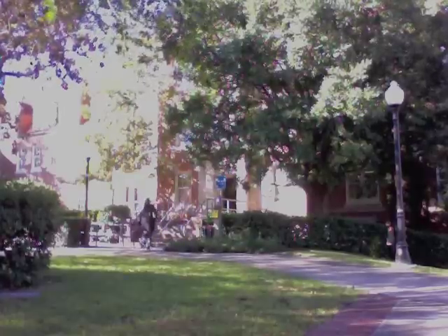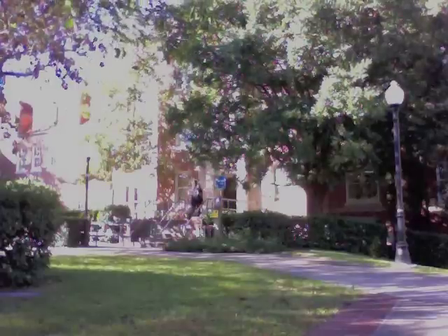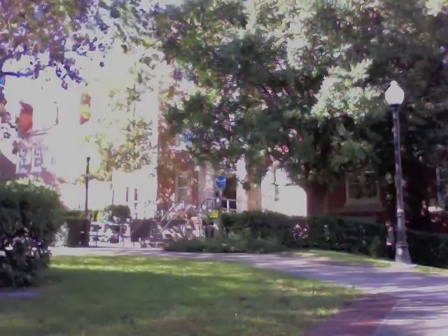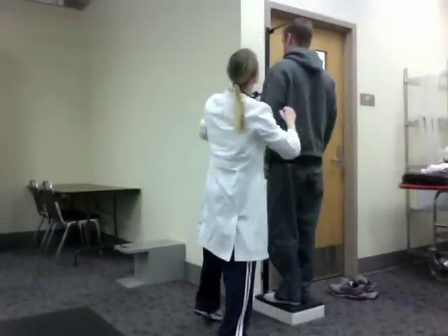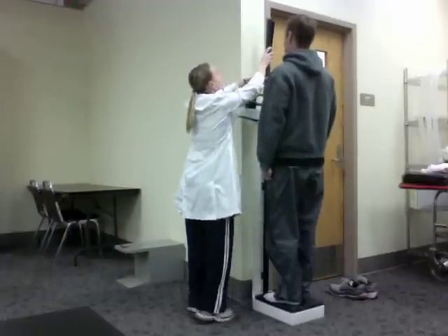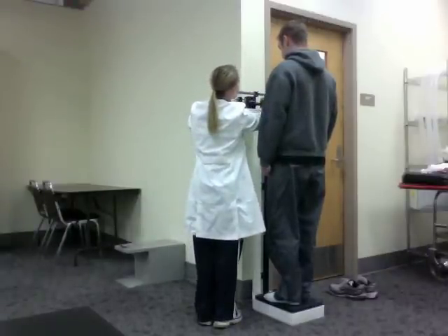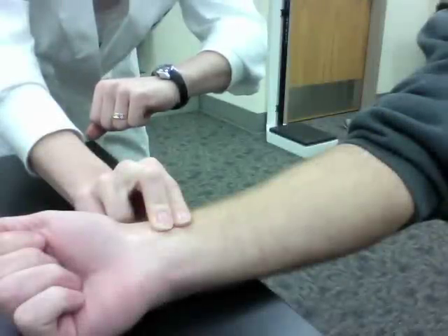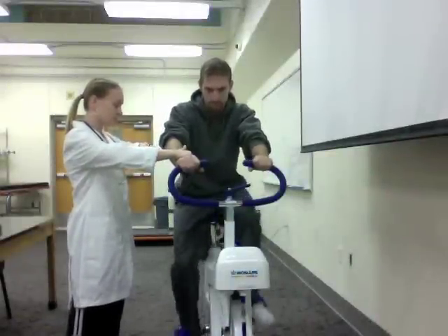When a person visits the doctor's office for a routine health screening or due to an illness or injury, a certain number of standard procedures are performed before the physician even asks the purpose of that person's visit. These standard procedures often include anthropometric readings such as height and weight, resting heart rate, oftentimes exercising heart rate, and blood pressure.